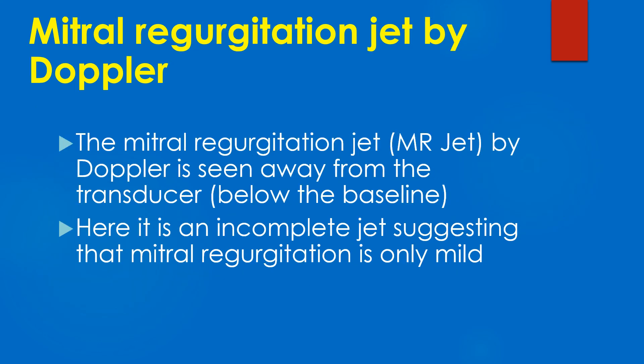The mitral regurgitation jet by Doppler is seen away from the transducer, that is below the baseline. It is an incomplete jet in this case, suggesting that mitral regurgitation is only mild.